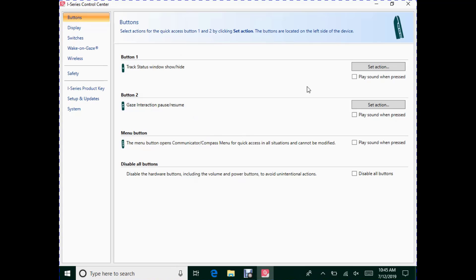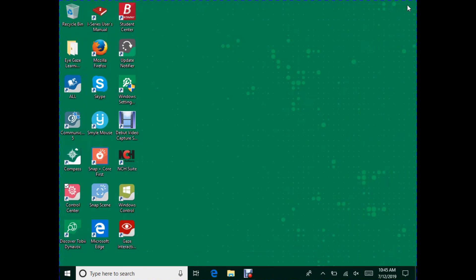Once you've selected your actions, hit the X at the top right corner, and now your buttons are programmed.